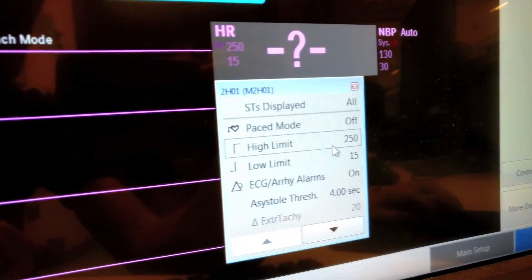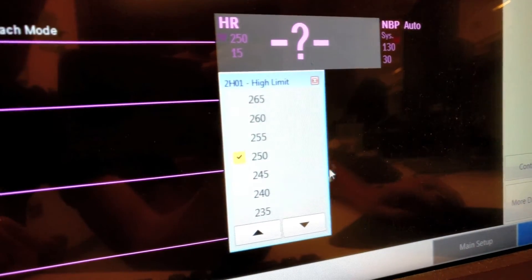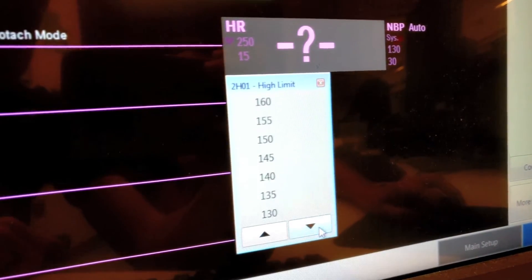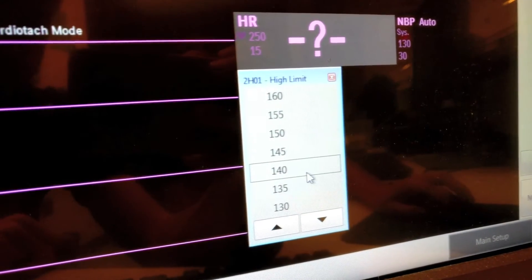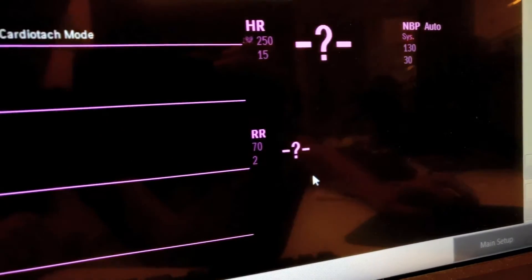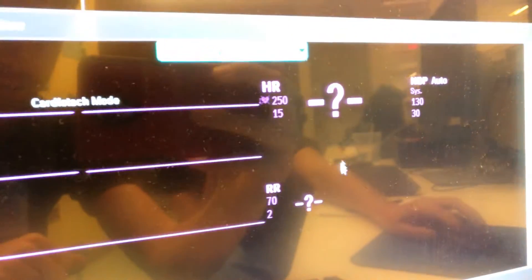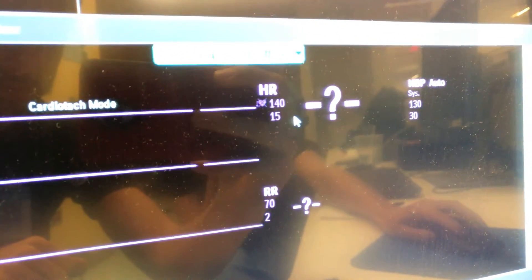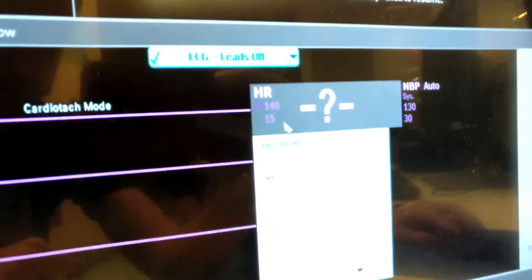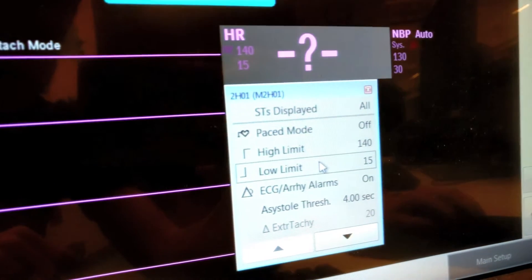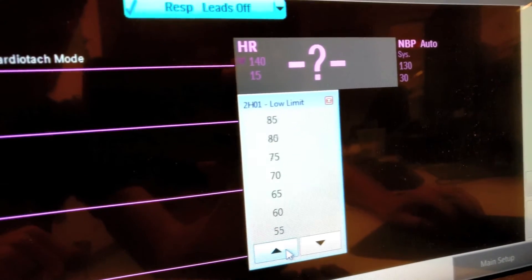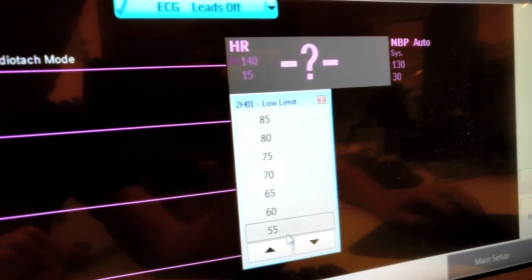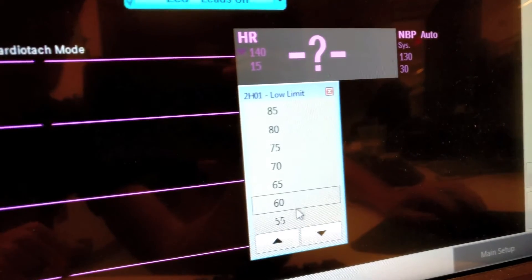After setting the patient's monitor to comfort, make sure to go directly to the nurse's station and reset your alarms as many alarms will be turned off. You want to make sure to reset your high and low alarm limits for heart rate, respiratory rate, and blood pressure.